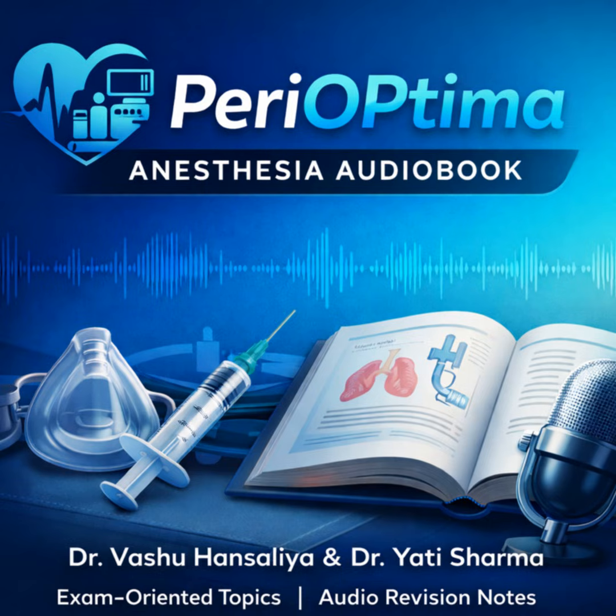Walk us through that map. We'll begin with gas supply safety. This covers all the passive indexing systems at the machine's interfaces, so cylinders and pipelines. The first point of contact. Exactly. Next is flow control safety. This deals with the mechanisms that regulate and mix the gases, especially N2O and O2. The mixing chamber, essentially. In a sense. Third, a critical subset, oxygen-specific safety. These are devices that react only to a loss in O2 pressure.